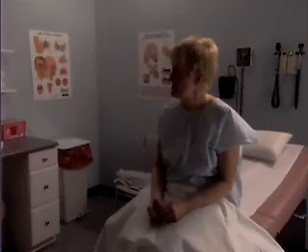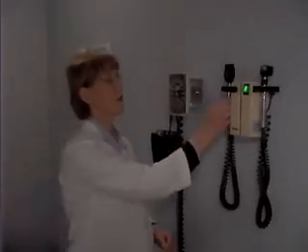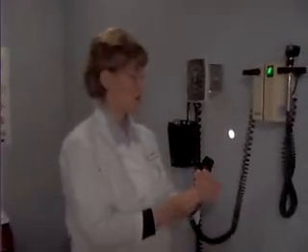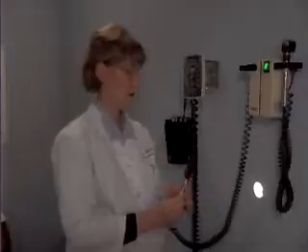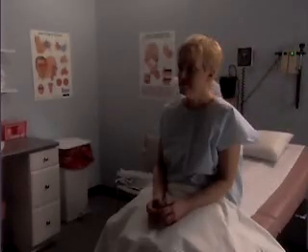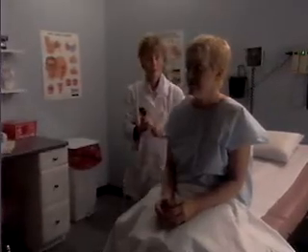Next, after darkening the room, conduct your ophthalmoscopic examination. Switch on the ophthalmoscope light and adjust it to the large, round beam of white light. Also, make sure the light is set to the appropriate brightness. Set the ophthalmoscope to the 0 diopter. Ask the patient to look over your shoulder at a specific spot on the wall. Now look straight ahead at the dot on the back wall.